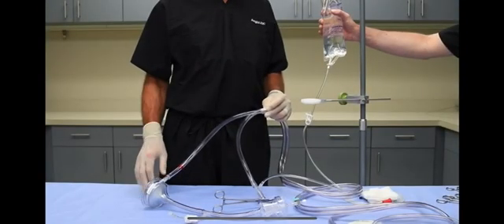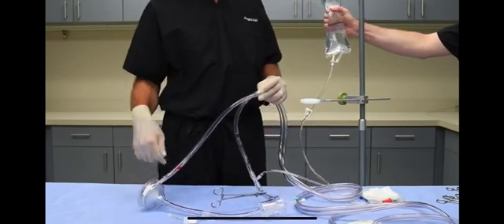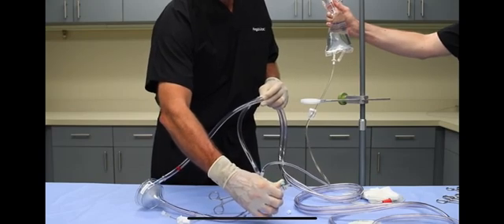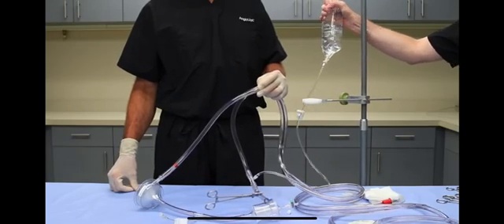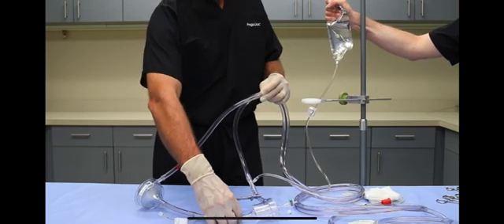With pressure applied to the fluid bag, undo the clamp on the priming line. Open the stopcock at the top of the bubble trap, allowing air to escape while priming the circuit. As fluid travels through the circuit and reaches the outlet of the pump head, tip the pump head and filter assembly upright to allow the fluid to fill the pump head.